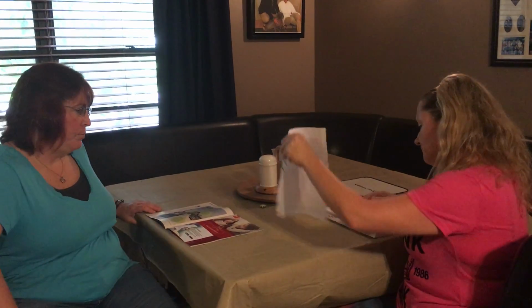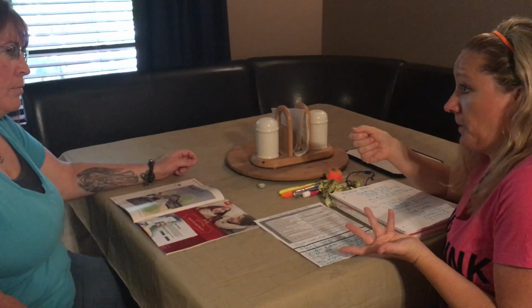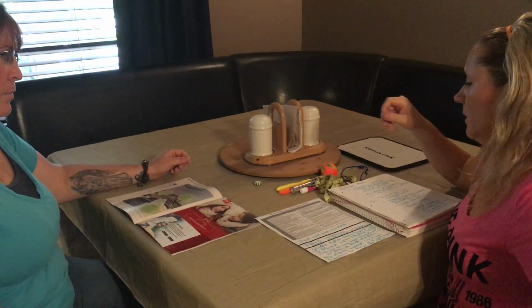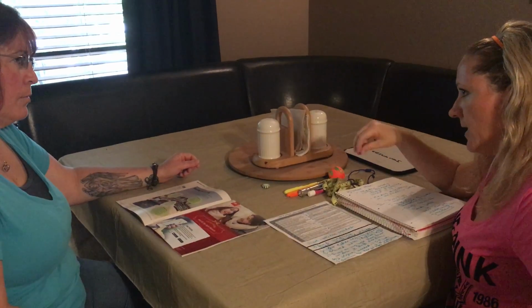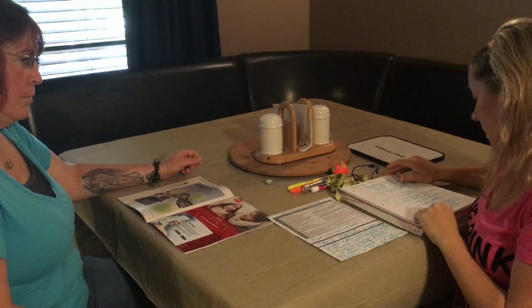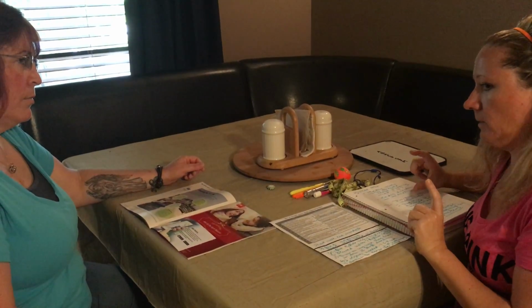So we really have to focus on various techniques again, how to improve this skill. And what we can do, especially for the reading, is use a magnifier, which is pretty simple. But also you can buy large printed material when you're trying to read, or large printed checkbooks, for example, or high contrast containers, for example, when you're trying to find your medications.